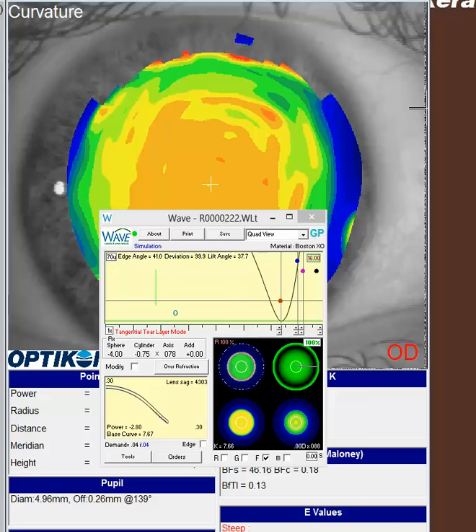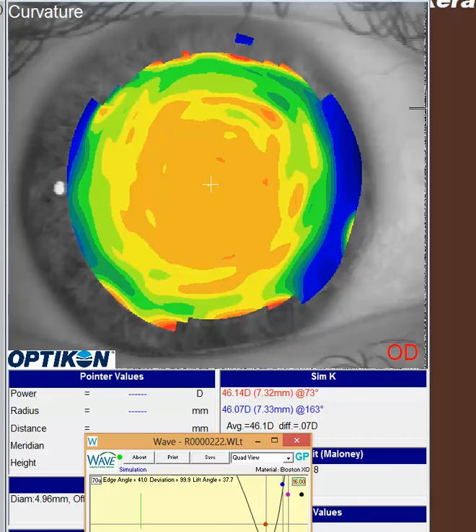But if we look at your patient here, from my understanding, you have pretty large pupils, and if we look at this topography, you'll notice we have this little steepened area that probably corresponds to about 7 to 8 millimeters. I like to look at these patients as almost a refractive patient, where instead of a perfectly nice smooth cornea, we have this distortion going through this transition zone in the cornea. When the pupil gets larger, we're probably getting some extra distortion from that little area through there. So the question is, how do we fix that?